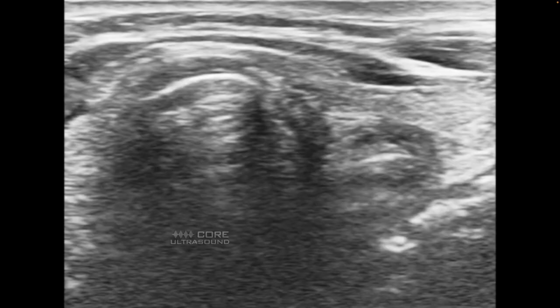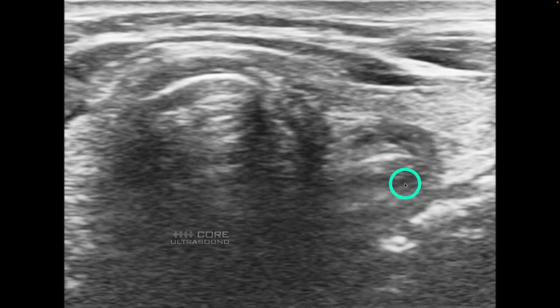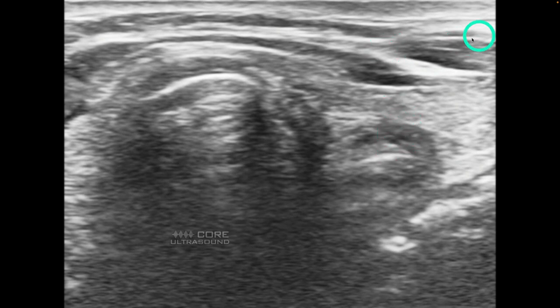Now the more you start using airway ultrasound, the more you realize that the applications are pretty broad. There's a lot of things that you can do. This right here is by now hopefully a familiar view - we have our trachea over here with some A-lines and shadowing deep to that. And over here we're seeing a nice compressed esophagus. This is actually the inner lumen right here, and here the wall of the esophagus with some muscle and probably some thyroid out there.